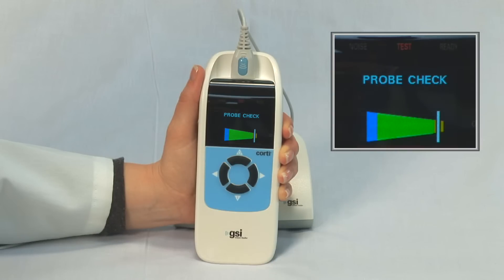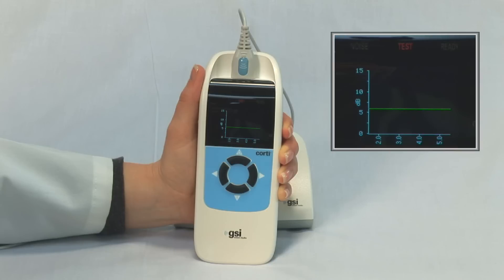The operator should inspect the probe tip for possible occlusion and replace if indicated, or reposition the probe in the patient's ear and restart the test. With proper insertion and seal, the probe indicator will be securely in the green portion of the cone. The Cordy will begin an in situ calibration and automatically start the test.